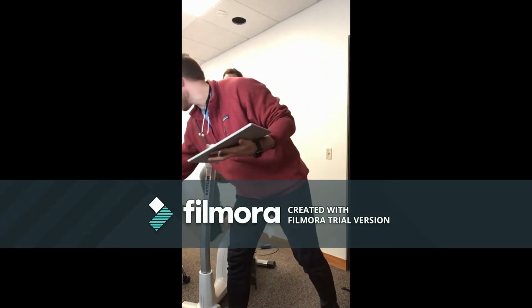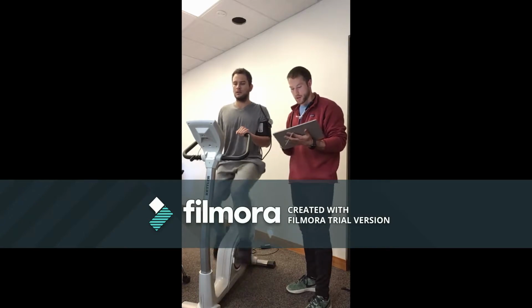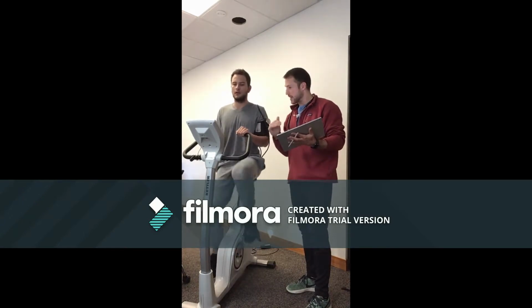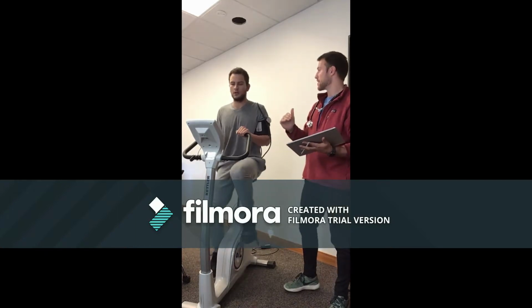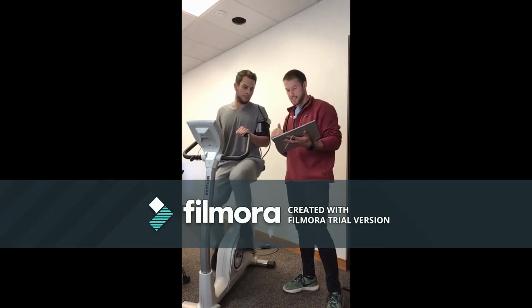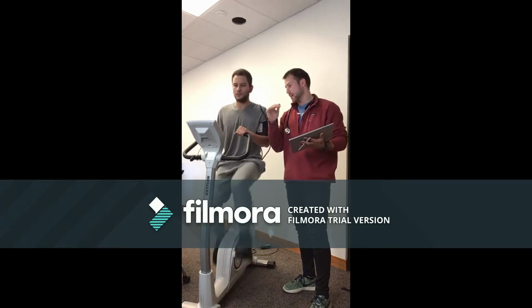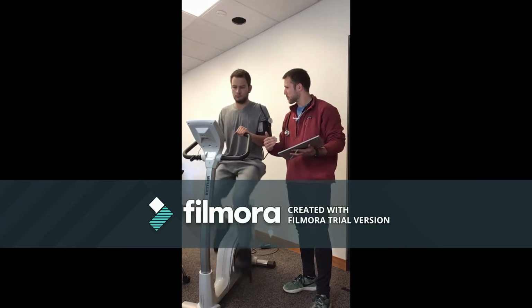So, we've got another minute or so, and then we're gonna take your vitals again. So at the 5th minute and the 6th minute here, we're really looking to see whether or not your heart rate is within 5 beats per minute of one another. That's gonna tell us that we've reached that steady state here. So that's kind of what we're hoping for. And if it's within 5 beats per minute, we're gonna go ahead and start the cool down. I'll explain a little bit more of that when we get to it.